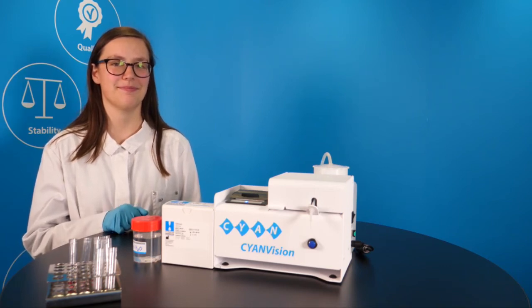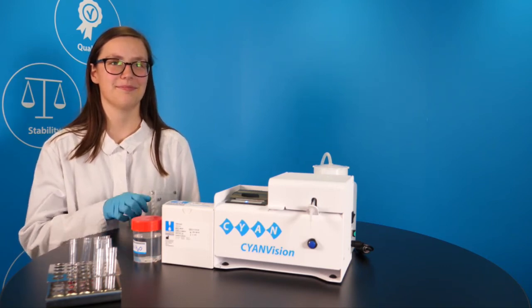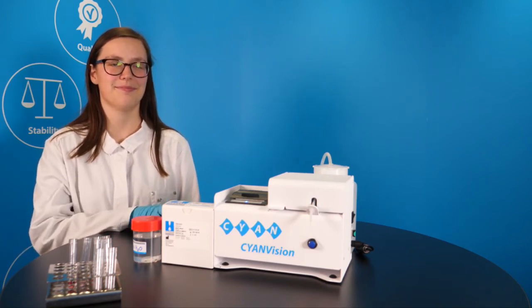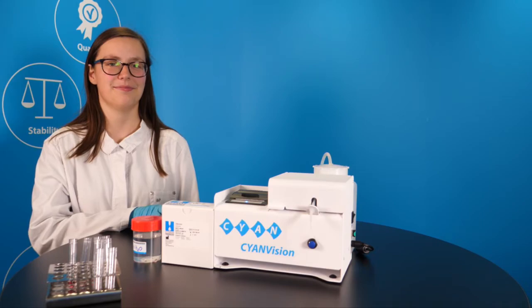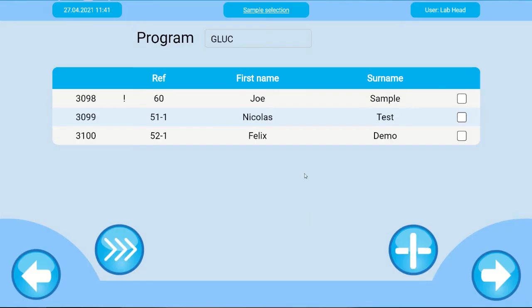In this video we will show you how to measure patient samples with the CyanVision. All patients for which a glucose test is required are shown here. Select the patient for which you want to start the glucose test now.